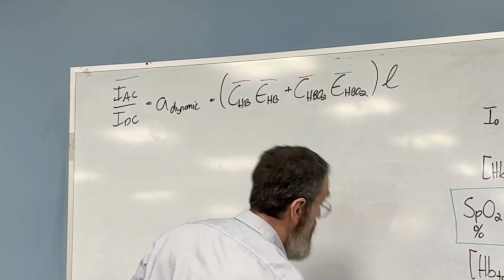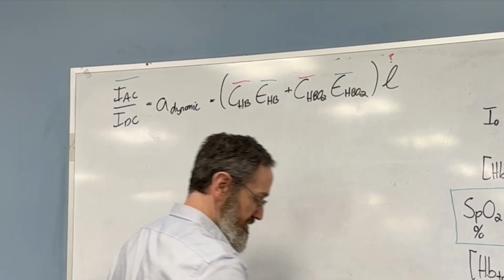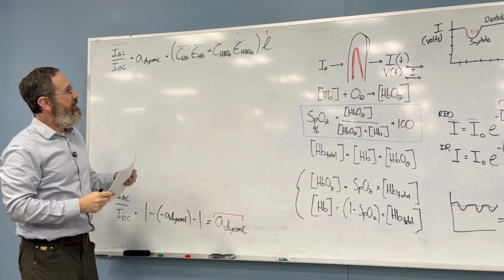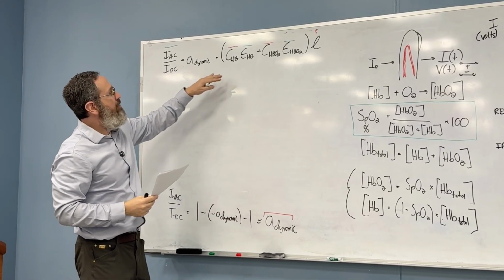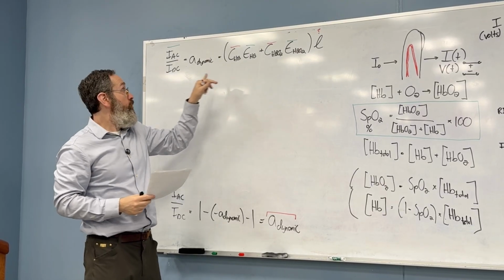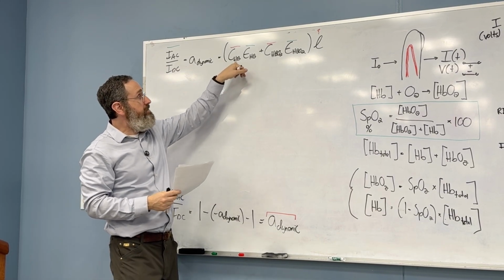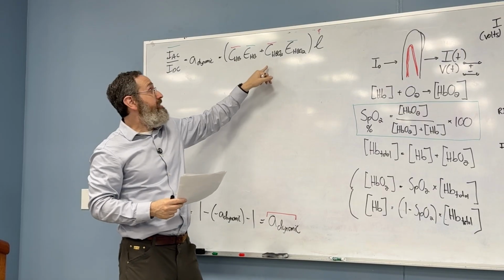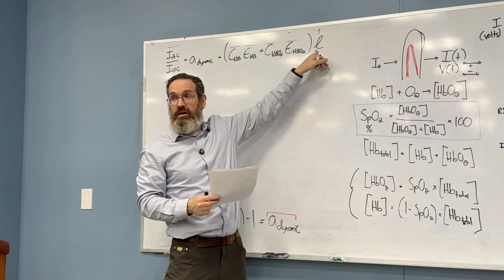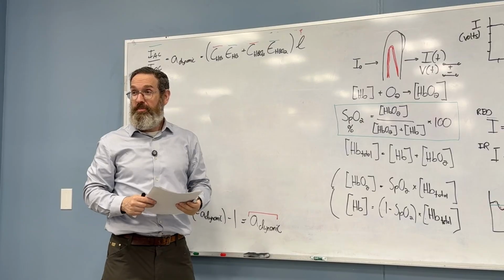We do not know this, and we have this, and we have this. Oh, so we're not there, right? Because we have three unknowns. We have one number, but I don't know how much deoxyhemoglobin Emily has. I don't know how much oxyhemoglobin Emily has, but I also don't know the dynamic length of her capillaries. Okay, what do we do?